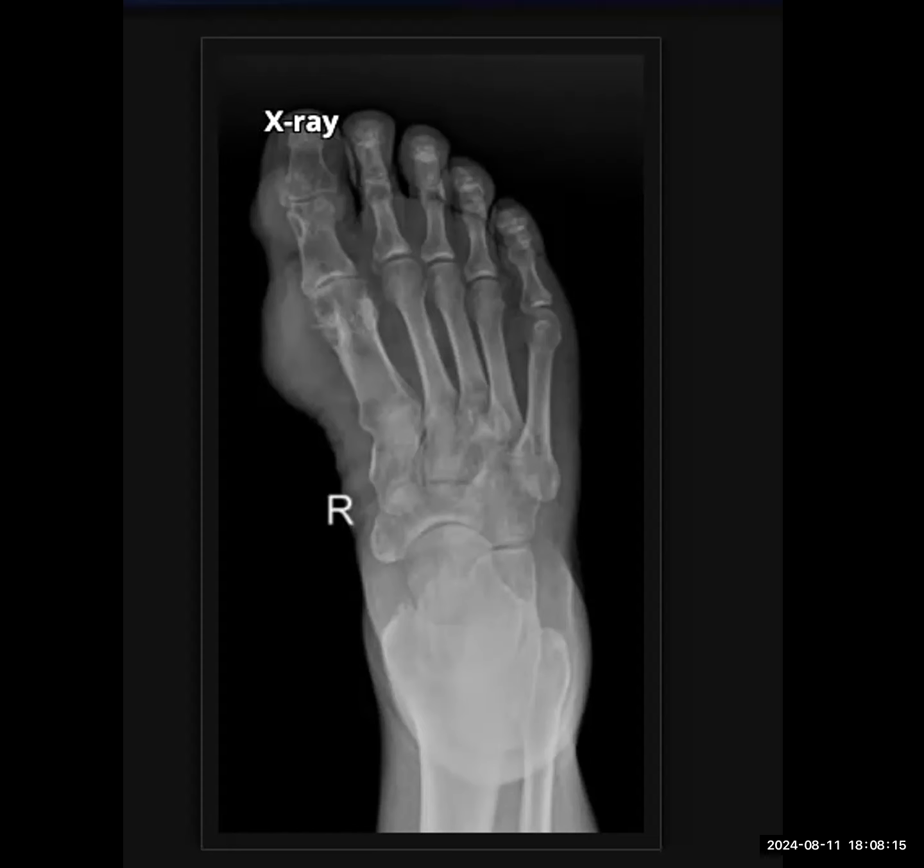Okay. No, I'm asking, is there any imaging technique that can help me differentiate between monosodium urate crystals and calcium? We could do a DECT. Could you expand it for me? I'm sorry, dual energy computed tomography would be able to differentiate between the two, where the classical appearance is green color crystals in the metatarsophalangeal region.